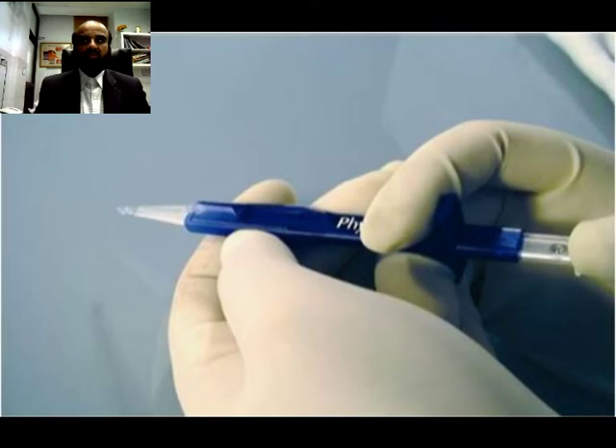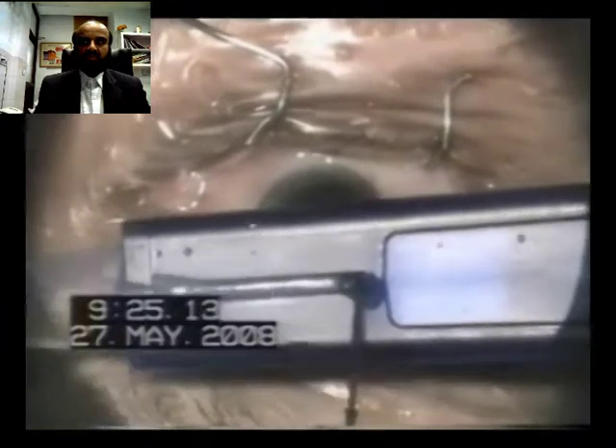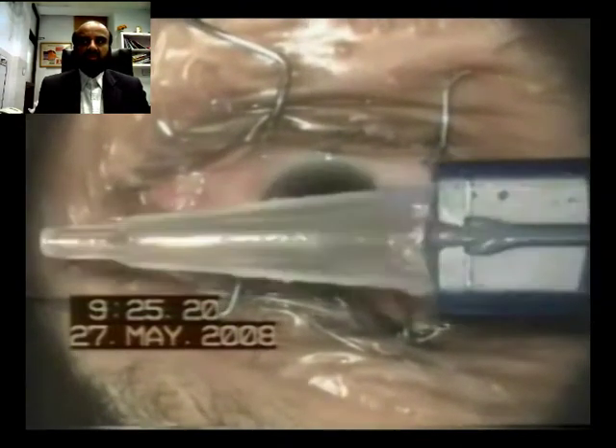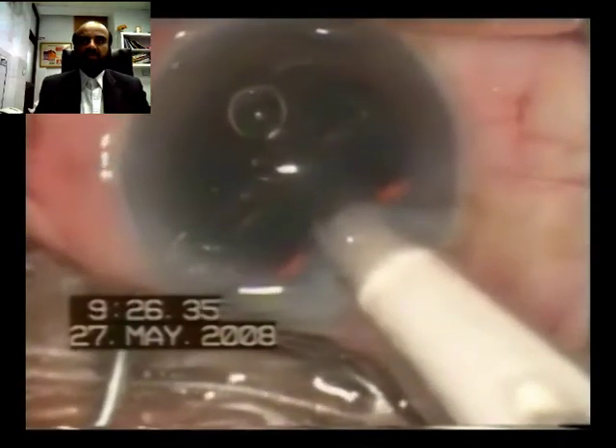The Phase IOL 1-2-3 preloaded IOL insertion system consists of a plunger and a cartridge. The first step is to assemble the plunger with the cartridge. A little viscoelastic is injected into the cartridge and it is filled with viscoelastic material. As we push the plunger, the sleeve moves into the cartridge, taking the IOL in front of it.